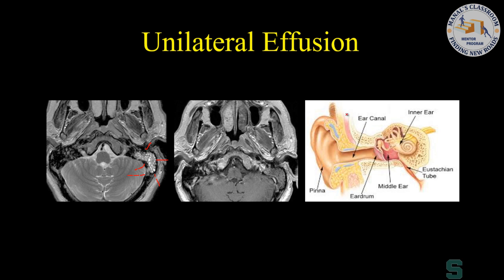Due to what? Due to what? Good. Why would a nasopharyngeal carcinoma result in obstruction? I'm going to keep asking you until... So you're exactly right. Realize that the back of the pharynx is connected with the middle ear cavity through this eustachian tube.